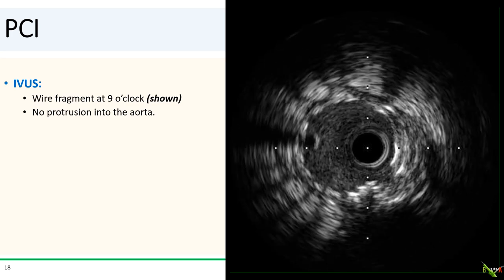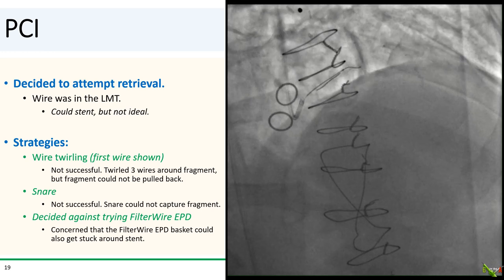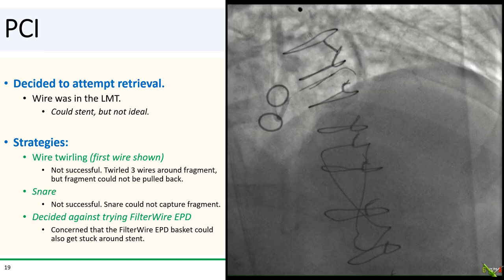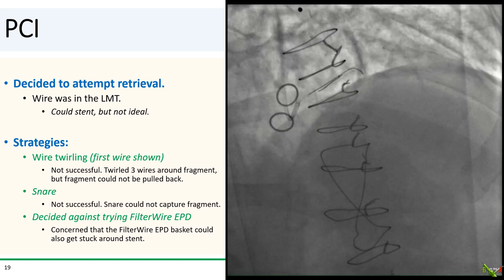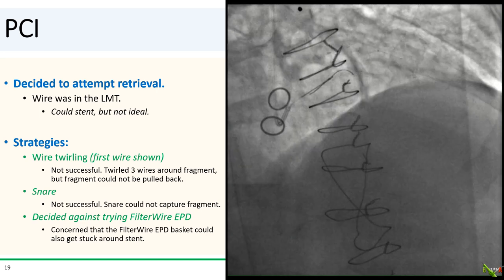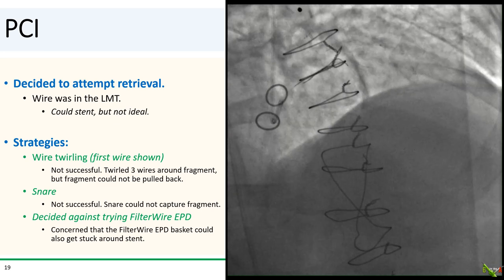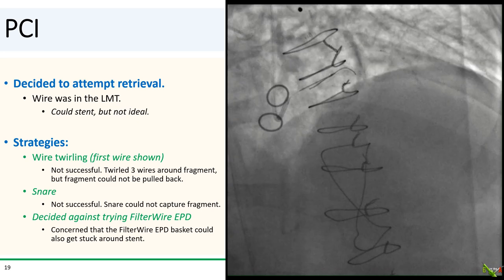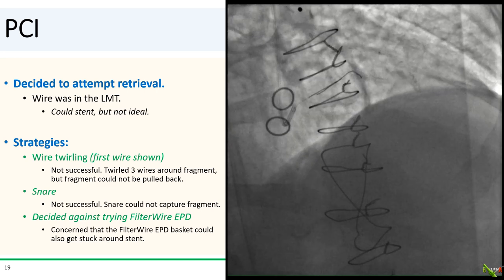In our case, we did IVUS, and you can see the wire fragment here at around nine o'clock. On pullback of the IVUS, the wire fragment broke cleanly in the mid-left main and did not protrude into the aorta, fortunately. We decided to attempt retrieval. The wire was in the left main into the LAD, which already had one to two layers of stents in it. Even though we could just stent over the wire, we thought it was not ideal. We first tried the wire twirling technique with three different wires around the fragment, but the fragment could not be pulled back, even using a guideliner. We then tried a gooseneck snare, but the snare could not capture the wire fragment either. We then thought about using a filter wire, but we were concerned that the basket of the filter wire could itself get stuck around our freshly placed stent, so we decided against it.